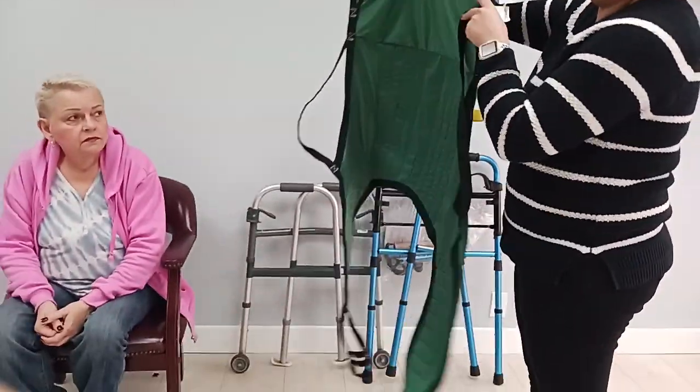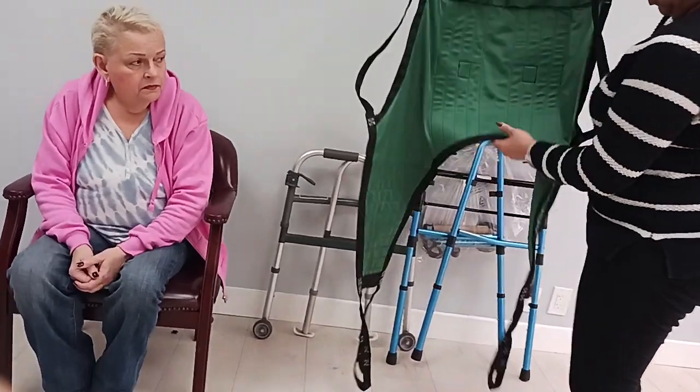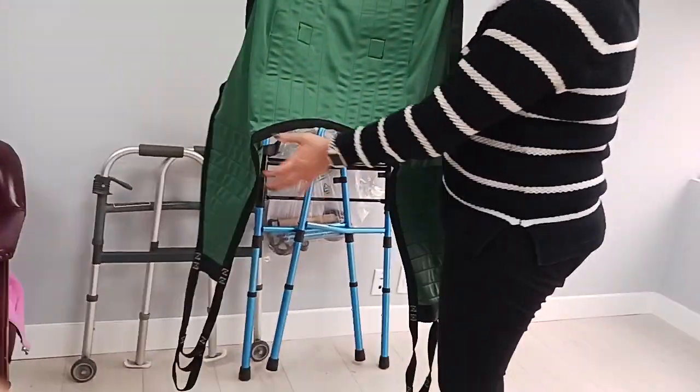Okay, that's the back. This is where the patient goes — they put their butt here. We've got to make sure this is as close to their butt as possible.